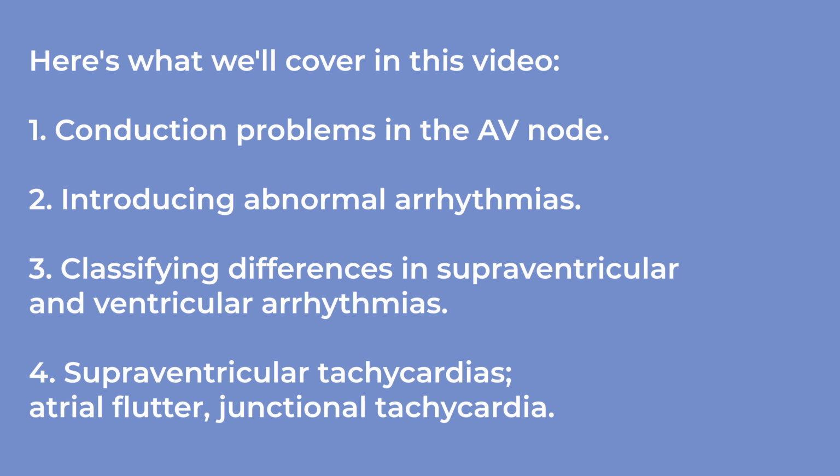And before we actually move on to start talking about the sequence to approach an ECG, I think it's important to try and understand what the abnormalities are. Because if you understand the abnormalities, then you're more likely to be able to pick that up when you're looking through the sequence. So we will come to the sequence, but this is the best way to approach this series.